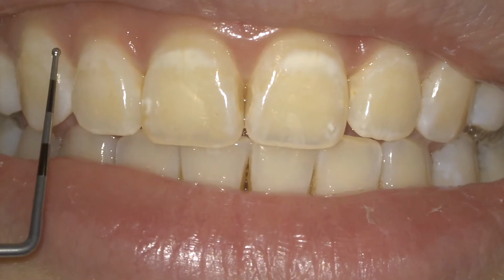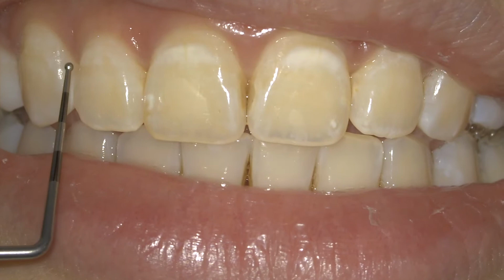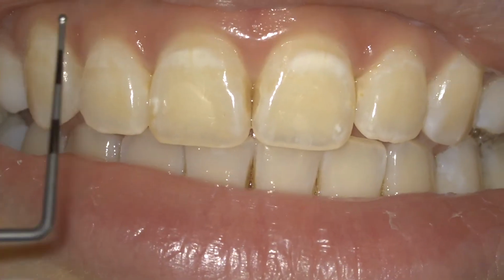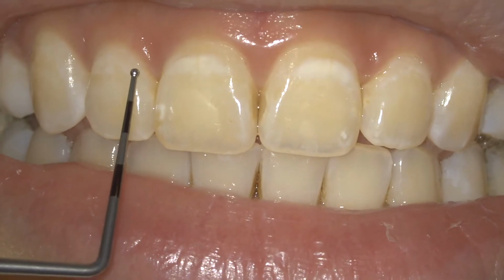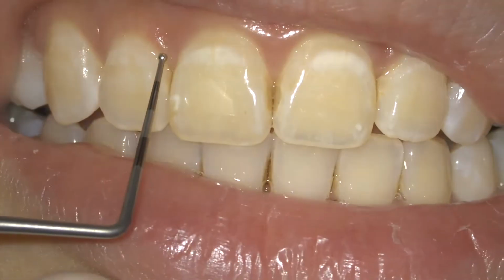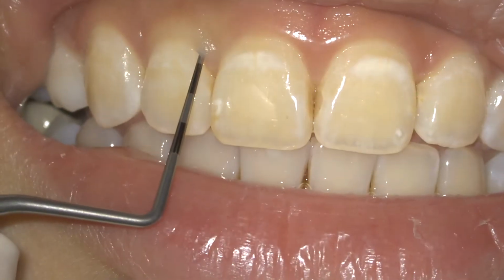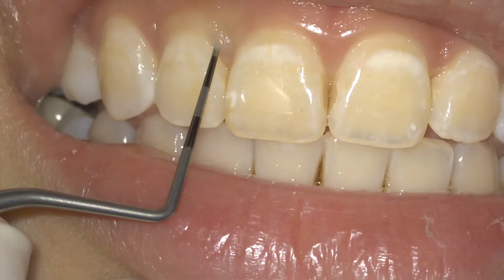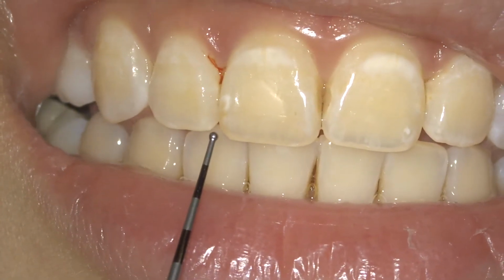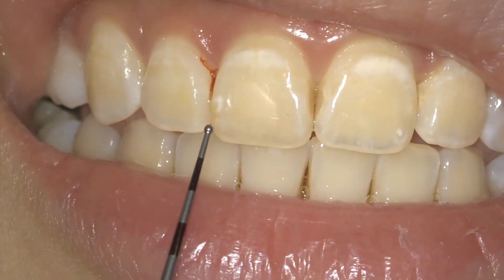And you can see this is the papilla, the interdental papilla. This index assesses the bleeding in the papillary areas. So you need to insert the probe into the papilla sulcus. You can observe the blanching as the probe goes into the base of the sulcus, and then you can take it out. Yes, you can observe there is bleeding noticed in the area.